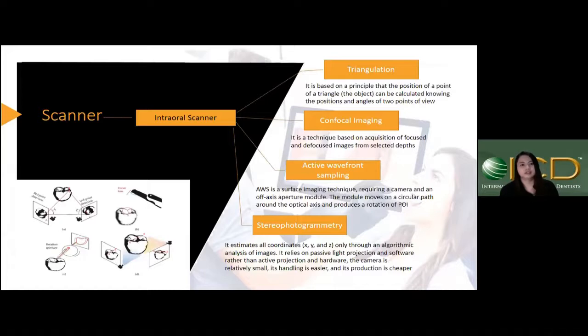And for the intraoral scanner, based on the working principle, we can also divide into four: triangulation, confocal imaging, active wavefront sampling, and stereophotogrammetry. But I'm not going to go into detail about the differences between these four. I will only tell you about triangulation and confocal imaging, because this is what we will discuss later in this presentation.